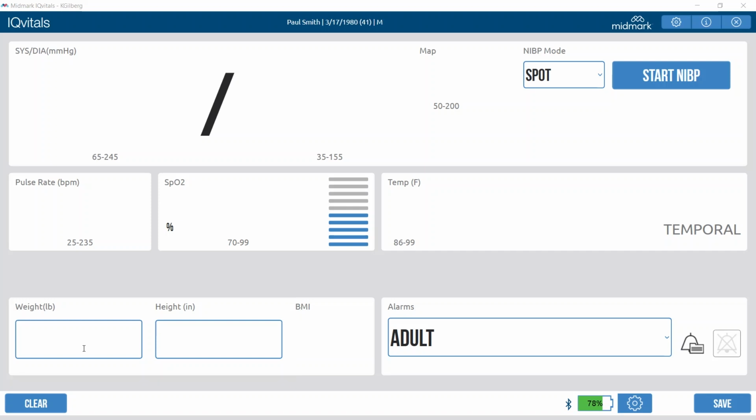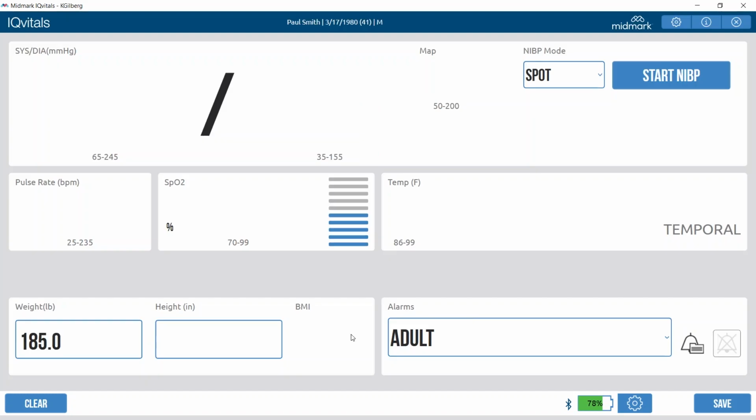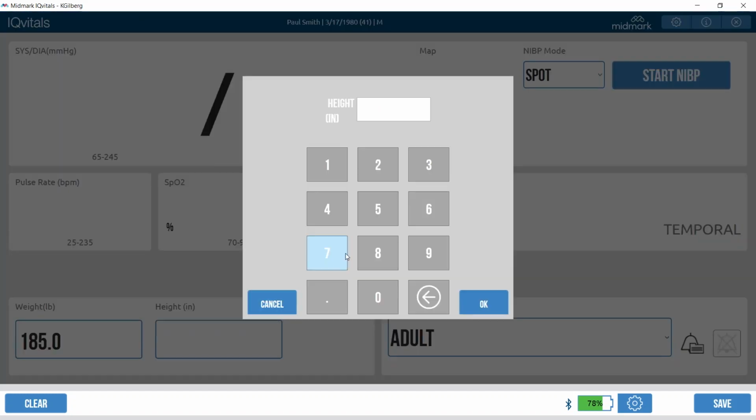Weight and height can be entered manually by pressing each corresponding button on the main screen. Touch inside the weight or height data entry box, and a screen with a numeric keyboard will appear where the data can be manually entered. Once the data is entered, press OK to save the data and return to the main screen, or press Cancel to return to the previous screen without saving data.